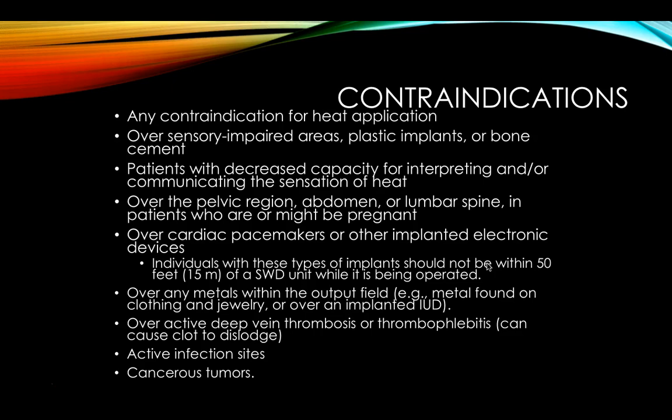Over the pelvic region, abdomen, lower back, lumbar region for pregnancy, that's been pretty common. Over cardiac pacemakers, implanted defibrillators, neurostimulators, any other implanted electronic device. In fact, those individuals should not even be within 50 feet of the shortwave diathermy unit while it's on. And actually, they say the same thing for pregnant women as well.